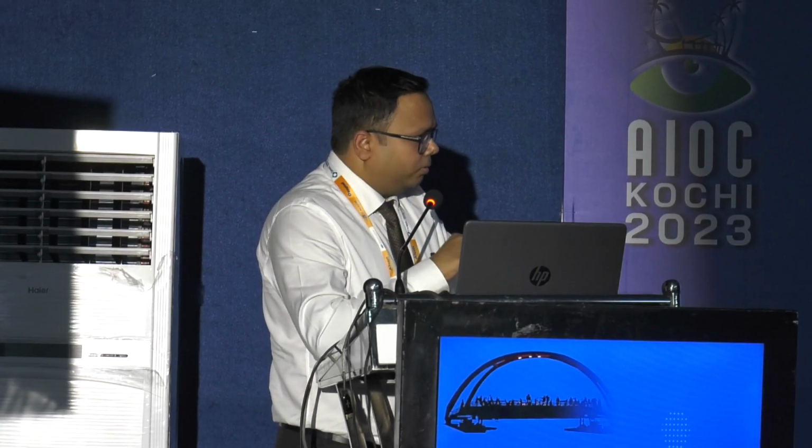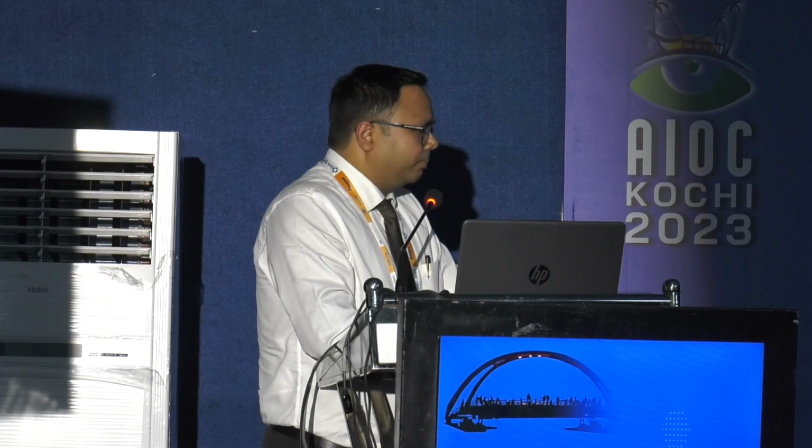If you are using forceps, first of all, below the PFCL you are not able to use it very much, and there is always a chance of injuring the underlying retina. So rather than using forceps, I personally like to use a soft tip. But yes, opinions can differ. I feel much safer with the soft tip.